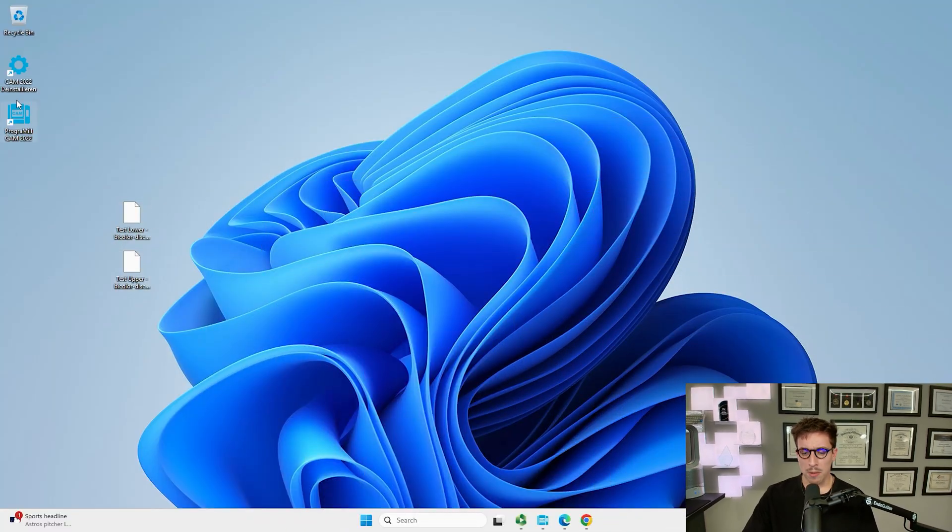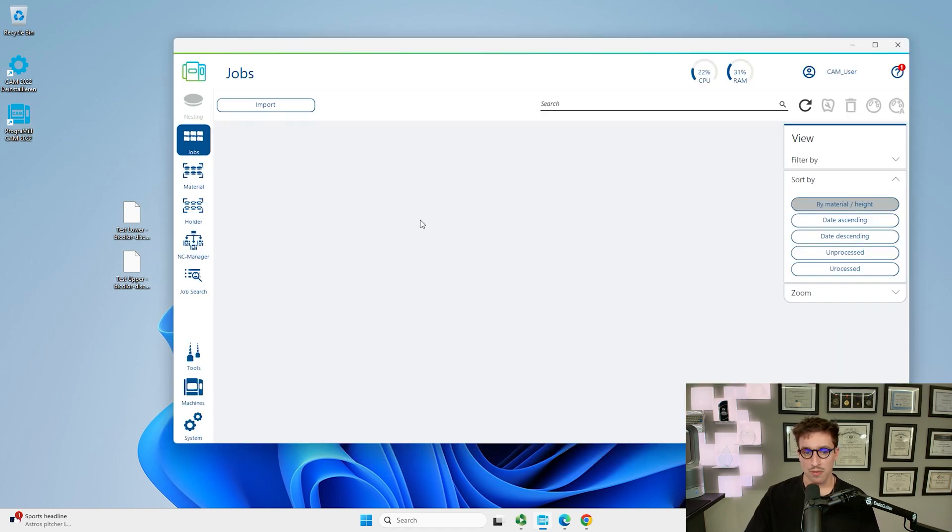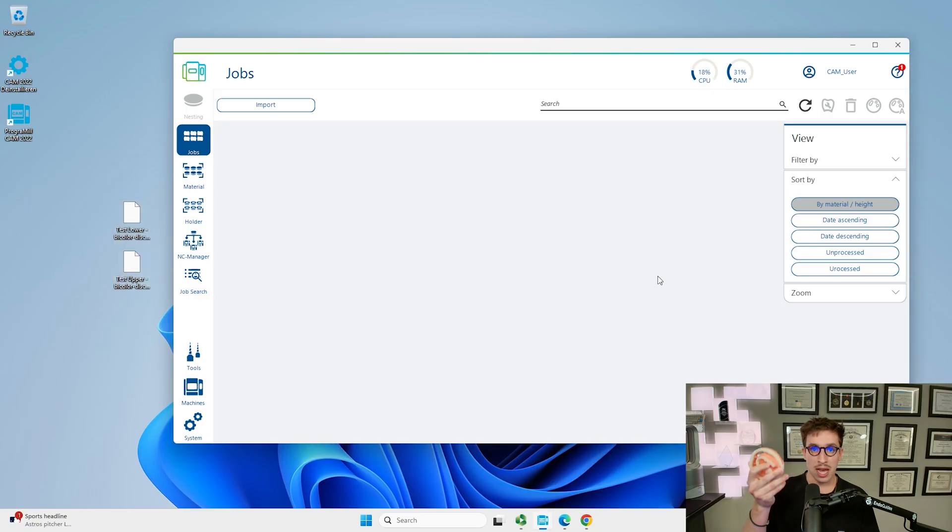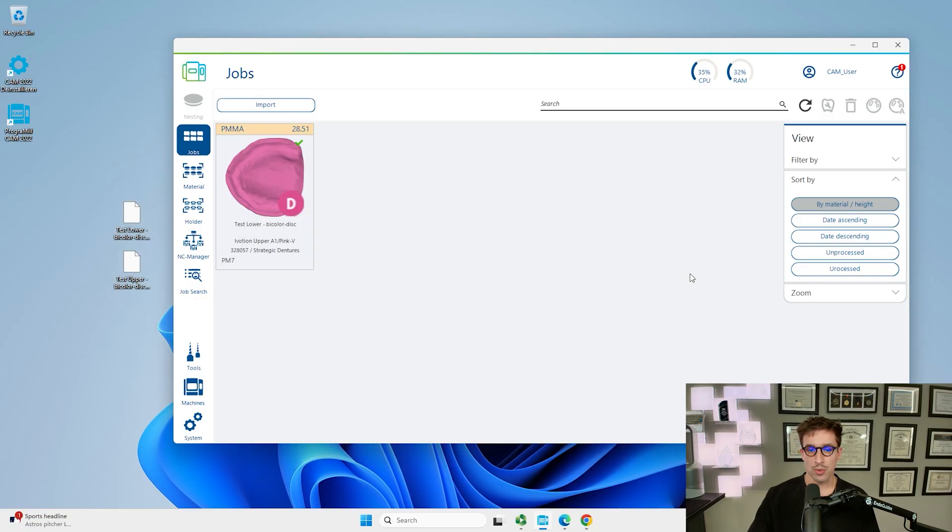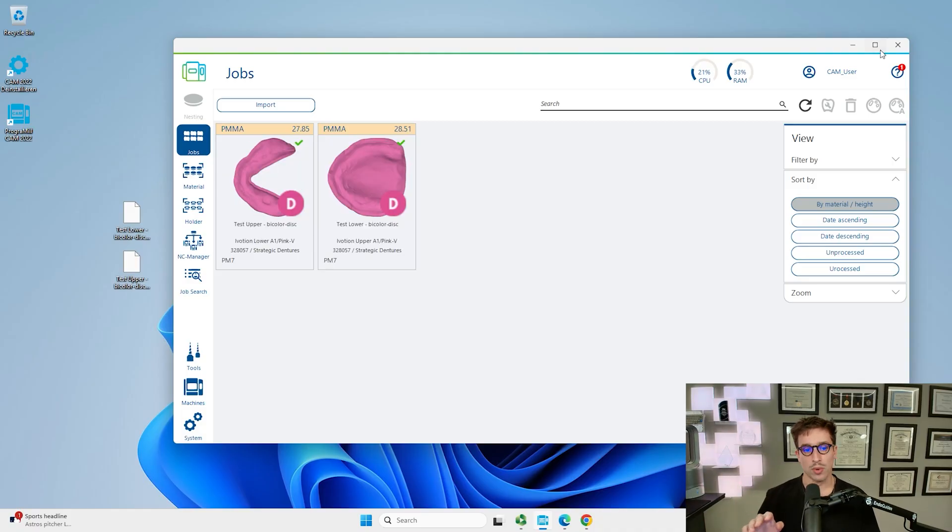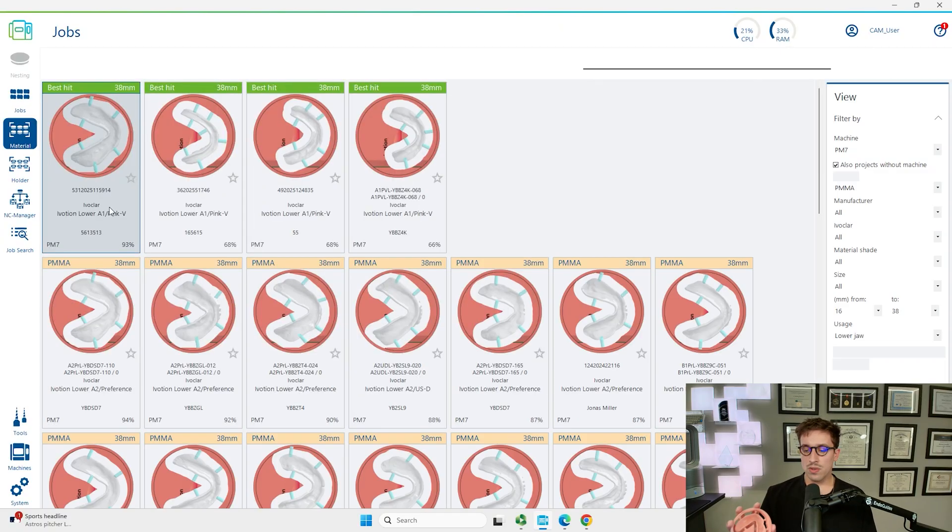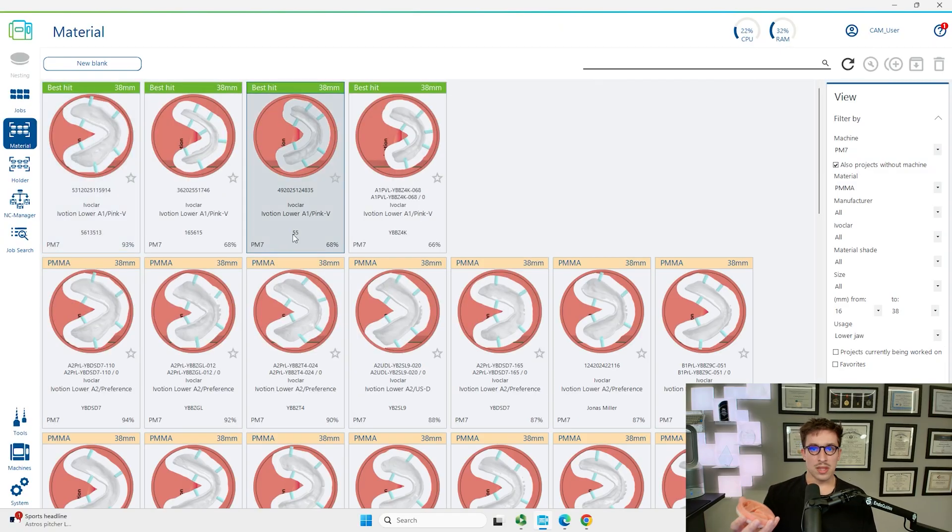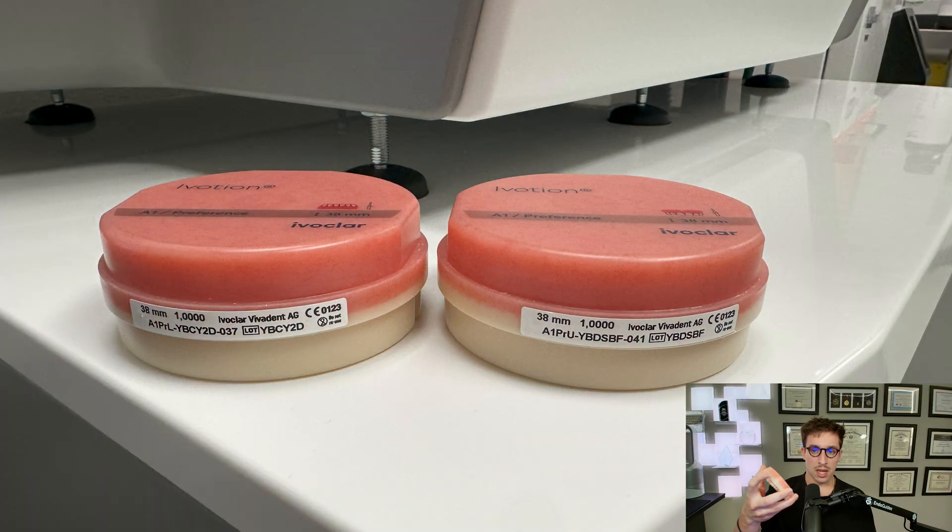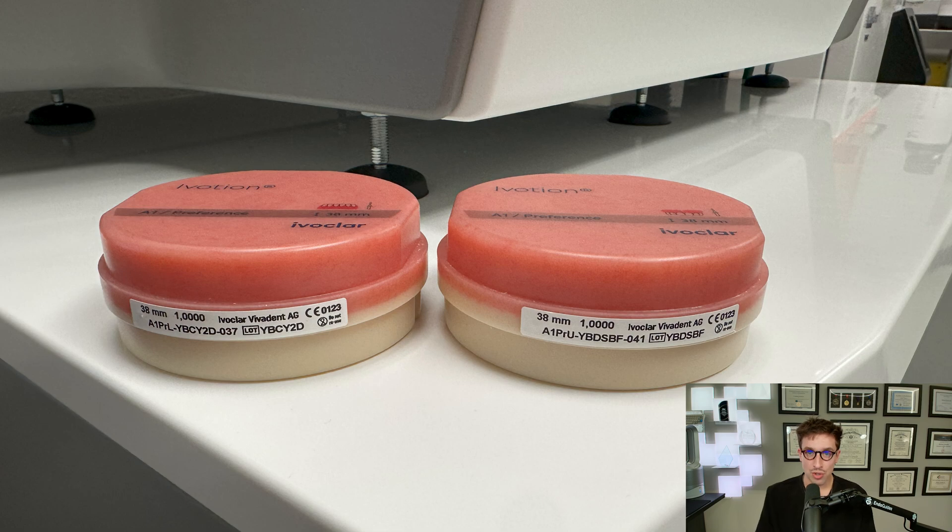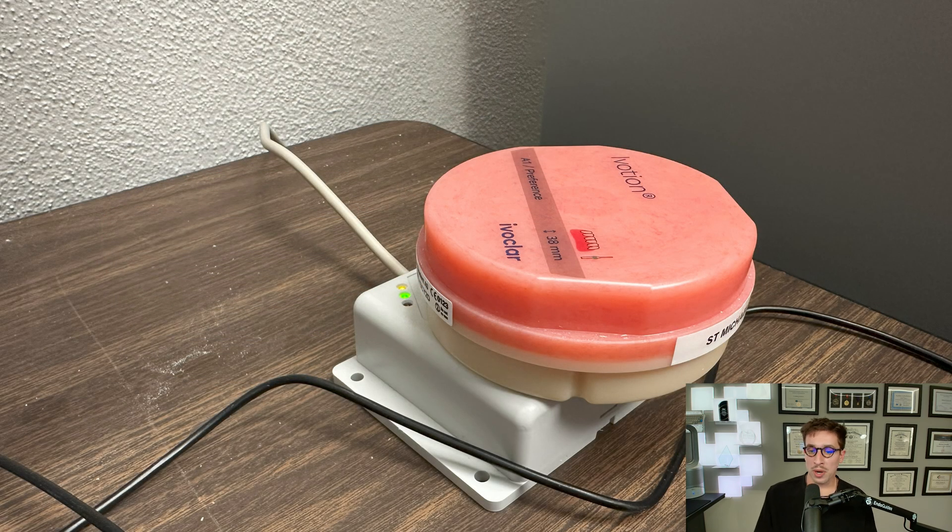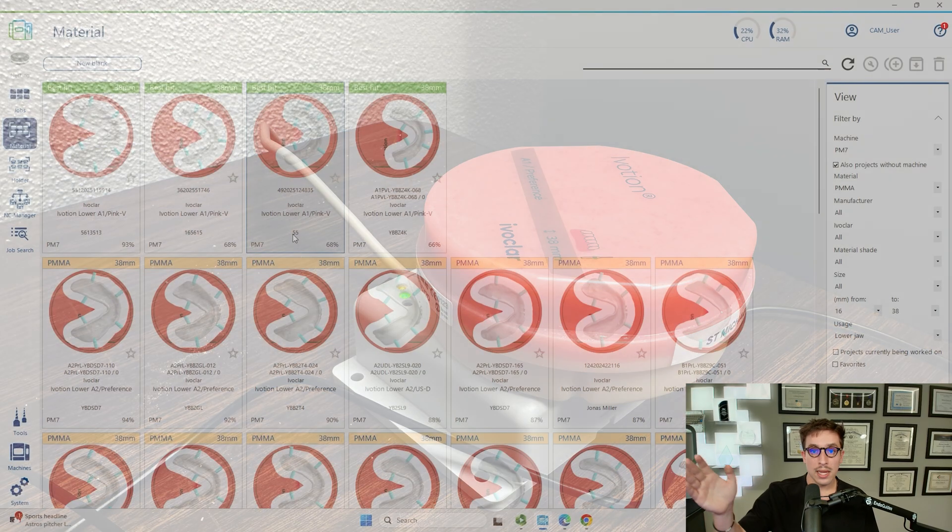Let's start off by opening up our computer and we need to make sure we have our two files and the program MillCam software as well. For the monolithic Ivocion dentures, we're going to use the bicolor disc option which are exported from your 3Shape design software. You can see here we got the maxillary and the mandibular one. We're actually going to be creating a new blank.